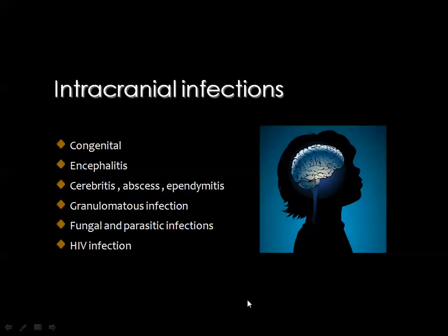The lesions are almost the same in the pediatric patient and in the adult cases, and we will discuss these issues from this point of view.